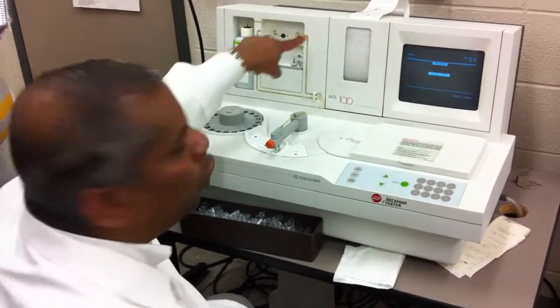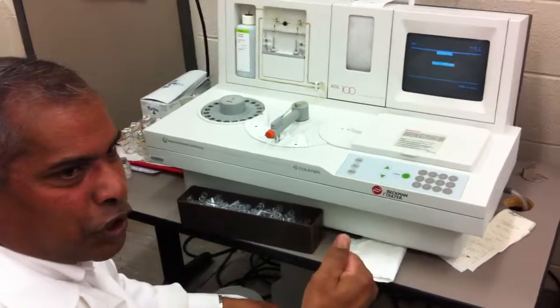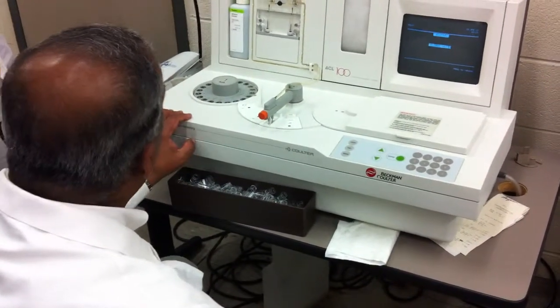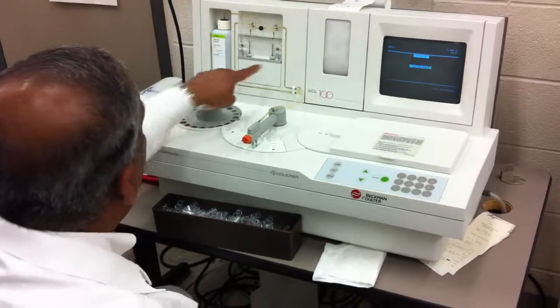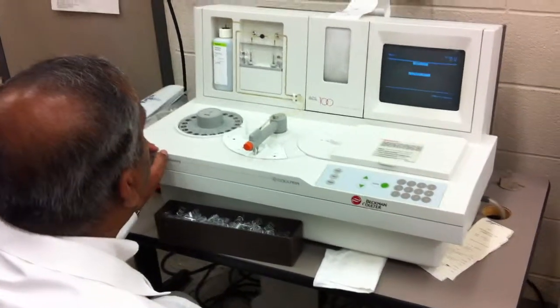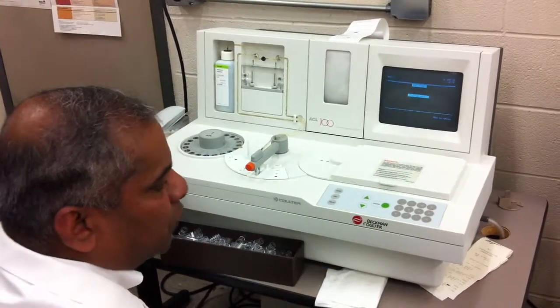So you don't want air bubbles. If you have air bubbles in there, then it's not going to measure the correct amount. So priming will allow for the release. Every time you use the machine, when you come in, you should prime it at least twice and make sure that you're not seeing any bubbles in these lines. It takes a couple of minutes to do the priming.